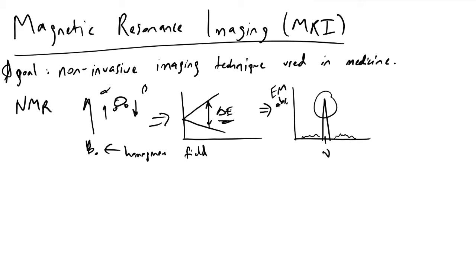And so when we go into a hospital room and into an MRI machine, what's going on here is in MRI, we create magnetic gradients along planes. And what essentially happens is in 2 dimensions, we are forming very strong magnetic fields, but they have different values depending on where you are along a particular dimension in space.